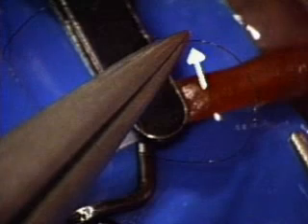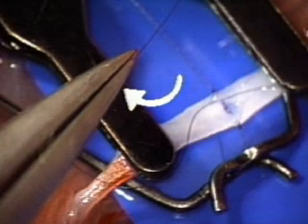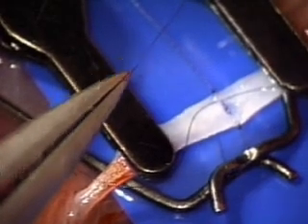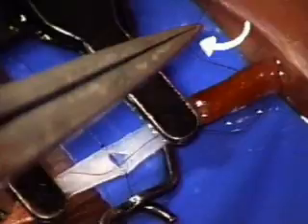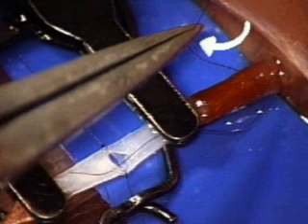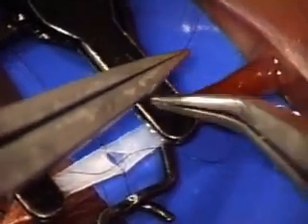This is right. Look how easily that loop was made. This is right too. The loop almost makes itself. But this is wrong. Look at this hassle. And this is wrong too. When you pick the thread up the wrong way round, it just refuses to be made into a loop.